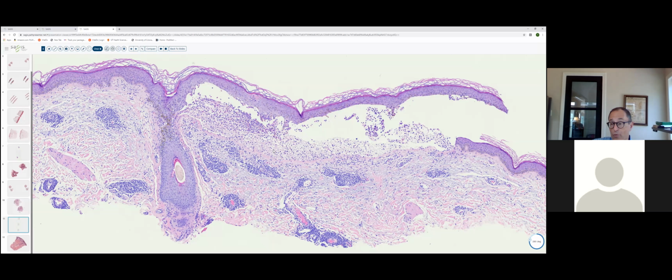This could be neutrophil-rich BP. The presence of eosinophils here would strongly militate against the possibility of bullous LE. And this could be EBA. So, the bottom line is when I see this, 9 times out of 10, the clinician's done a corresponding immunofluorescence and biopsy for DIF. If not, I'll get them on the phone and see if I can kind of ferret out what he was thinking clinically and what the patient looked like.